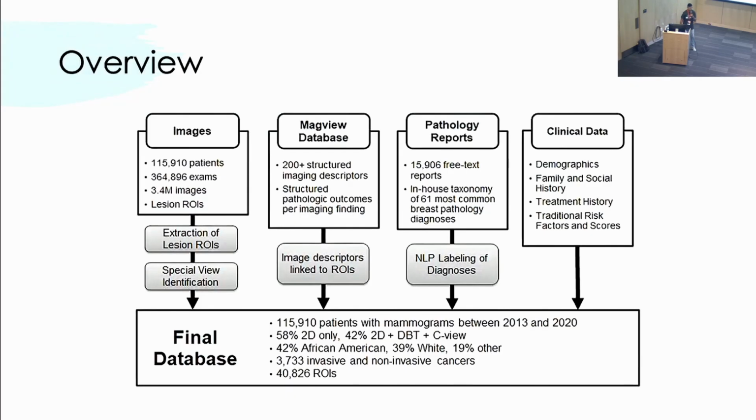This is the Emory breast imaging dataset, or EMBED. You'll hear it referred to many times. The key points here are it's about 115,000 patients and about 364,000 exams. So an exam is a full screening study or a full diagnostic study.